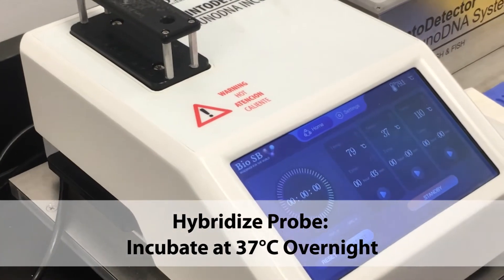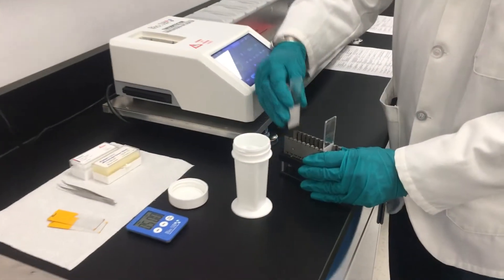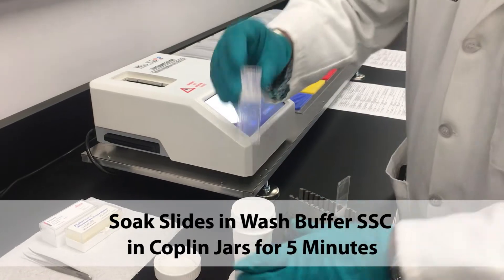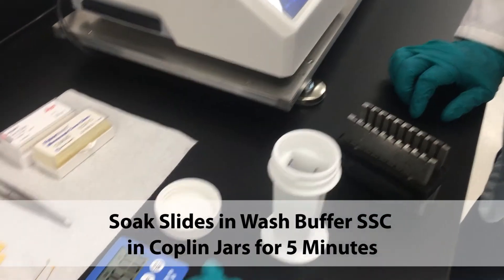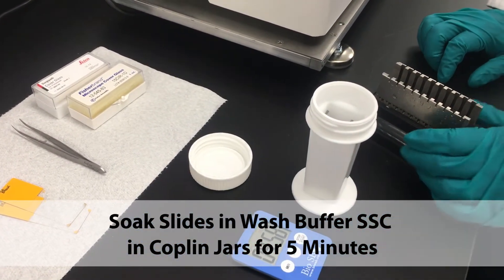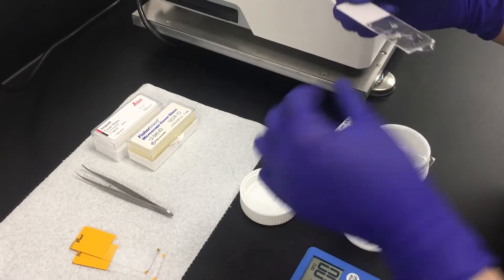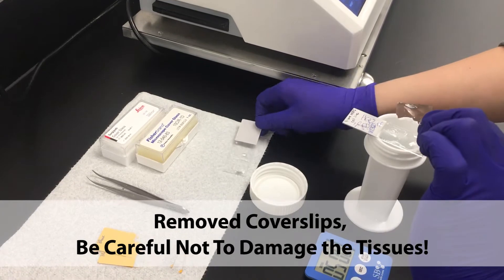Drop the temperature and hybridize the probe by incubating overnight at 37 degrees Celsius. After around 12 hours, remove the slides and pair them back to back and place them in Coplin jars in wash buffer for 5 minutes. Take out the slides and remove the cover slips, being sure not to damage any of the tissues.